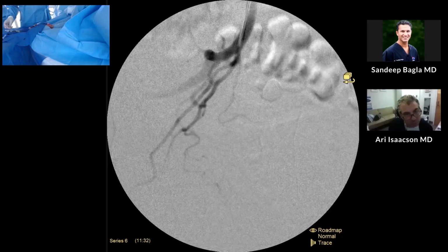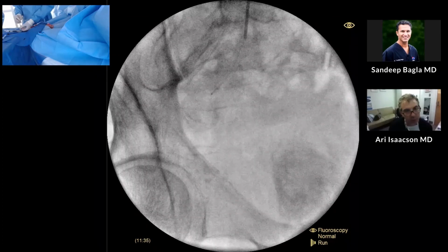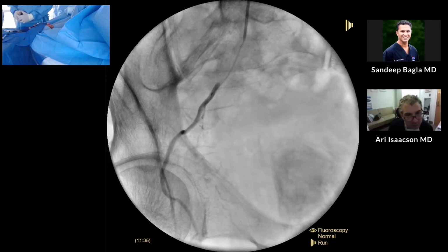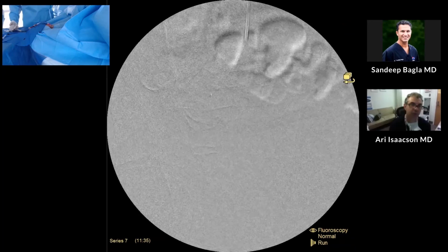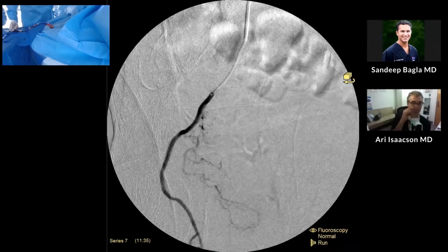You can see that prostatic actually cross anteriorly. So what I'll do is, once I'm here, even if I'm not in it completely, I'll just do a run from here. I think that doing a run through the microcatheter and identifying, is it below this vessel? Is it above this vessel? Where is it? Pudendal there. Yeah, so it looks like I'm in the pudendal artery, right? Yeah. And you see where the prostatic is. It's right there, exactly. So just by doing that run through the microcatheter, I was able to see that.